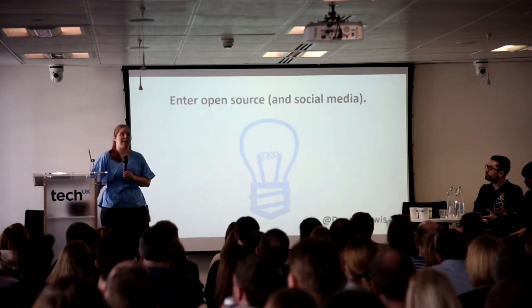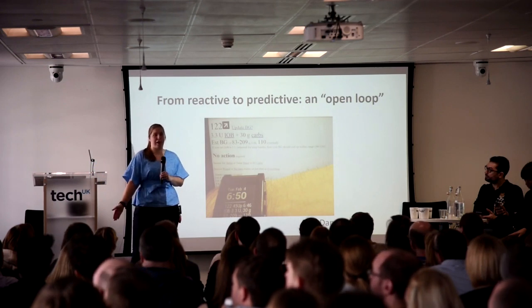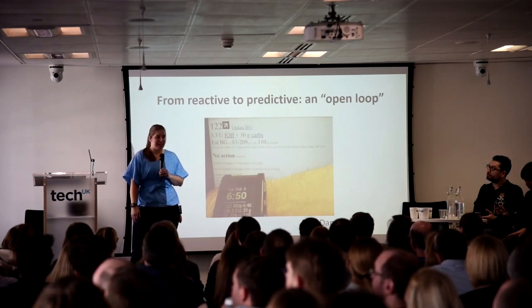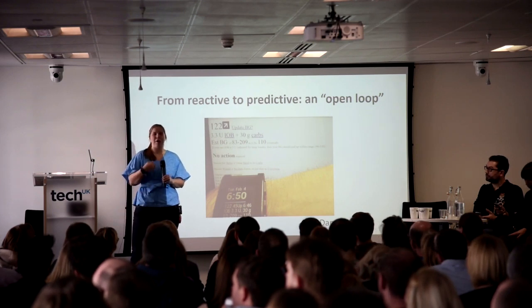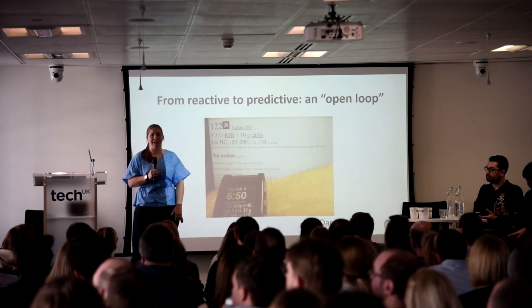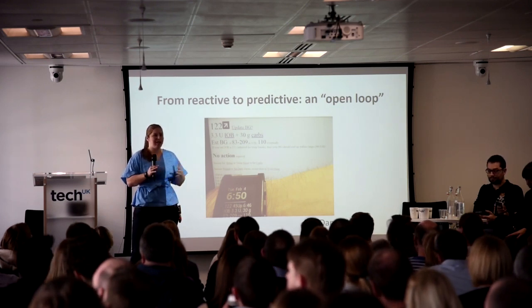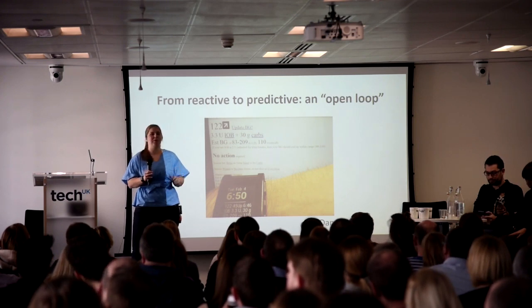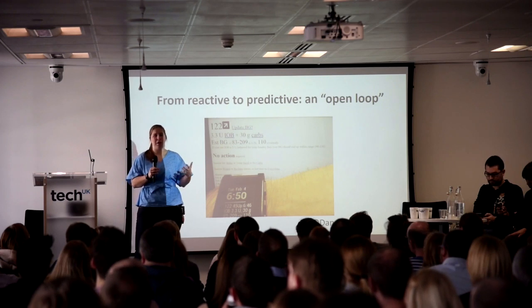And that's actually what we were able to do. John was kind enough to share his code, and we were able to build my first system that we jokingly thought was so cool. We called it DIYPS, the do-it-yourself pancreas system, because it did everything I didn't want to, allowing me to sleep. It would look at the data from my CGM every 5 minutes, and if I was going low or going high, it would alarm me. And I was able to use all kinds of alarms on my phone, make different sounds, change them periodically, and it worked really great. Within the first week, this system alarmed and woke me up.